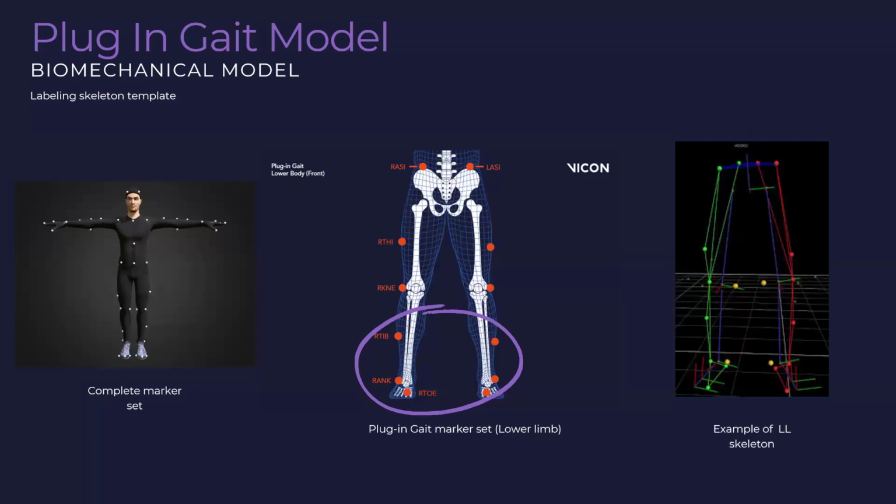Sometimes people are deficient in terms of movement or balance, basically. So there are balance trainings based on COP. When you stand up, you just don't move, but you can change the center of pressure. And sometimes there are games you can see on the screen with just some objects that you can move by changing your center of pressure. So in gait analysis, we check those centers of pressure and look into what they implicate in gait.